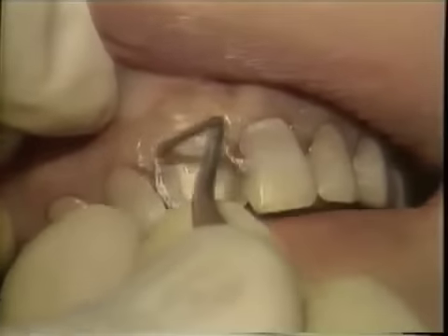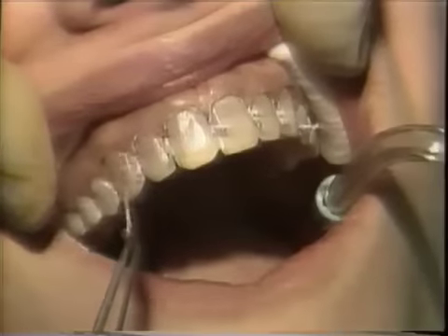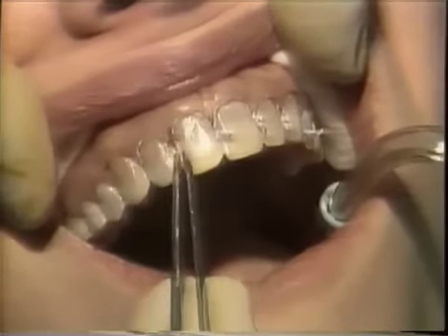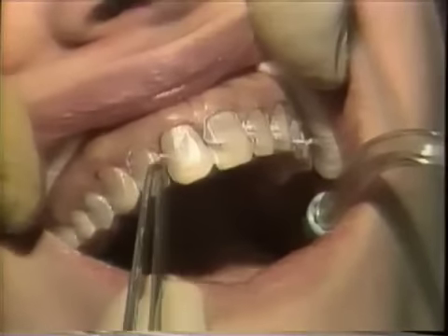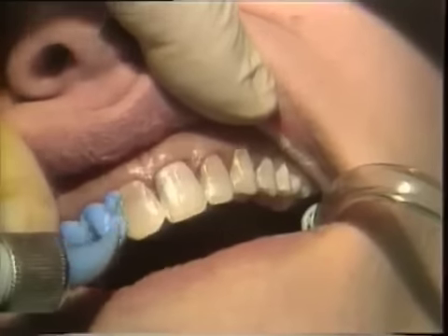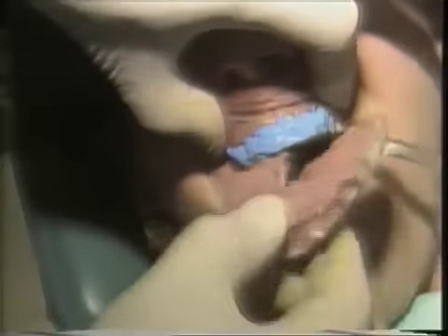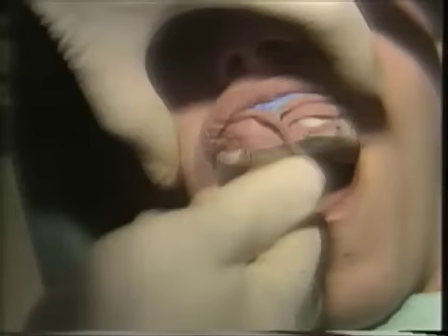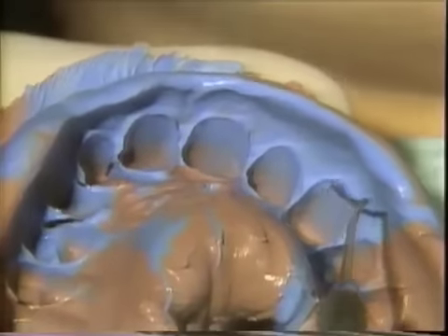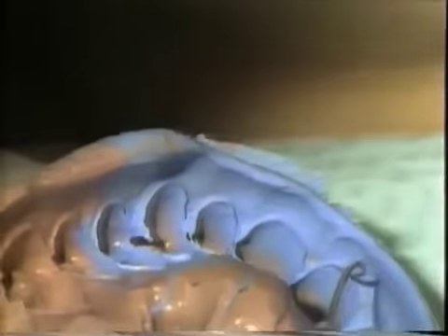The teeth are again carefully tissue packed, still in the tissue pack, to expose the finishing line under the soft tissue. After five minutes, the tissue pack is being removed prior to taking the impression. Polyvinyl siloxane impression material is carefully injected into the interproximals and under the soft tissue. The heavy body material is then placed over the injection material and allowed to set, then removed and inspected. There should be a clean, clear finishing line around all of the teeth.